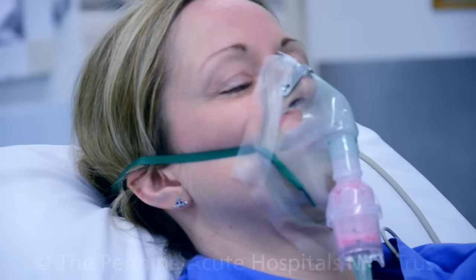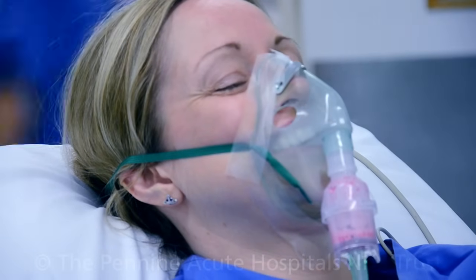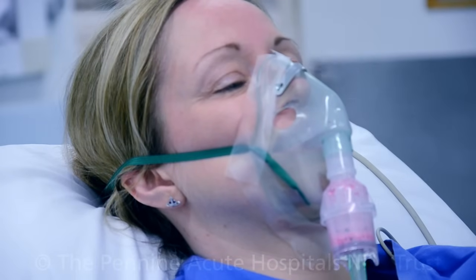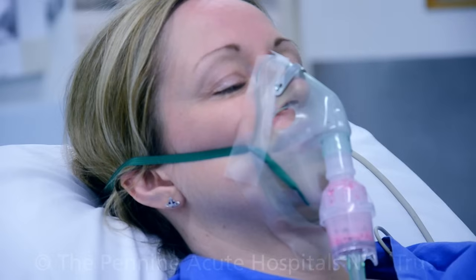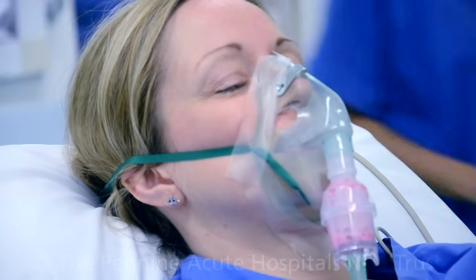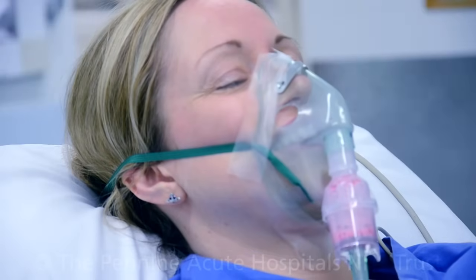Local anaesthesia, which is a numbing agent, is used to numb your nose, mouth and the back of your throat by different techniques. In the video, local anaesthetic is given through a face mask — this is called a nebulizer. This may taste strange and you will notice that your nose and mouth will gradually go numb.